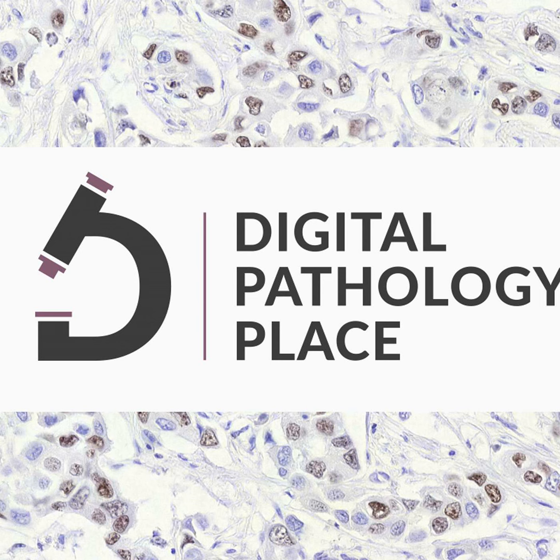So let's check the method we used: attention-based multiple instance learning with a vision transformer foundation model to classify whole slide images. And we are classifying them as either containing ovarian carcinoma metastasis or not, which is such a fantastic task for AI. You don't have to screen it, you get it pre-screened and then presented to you.